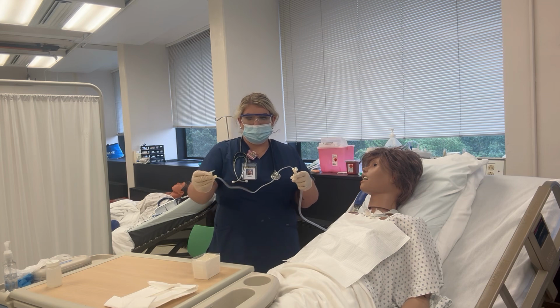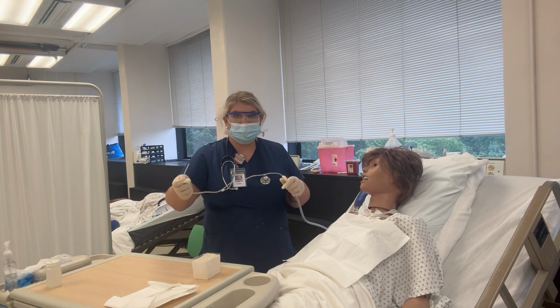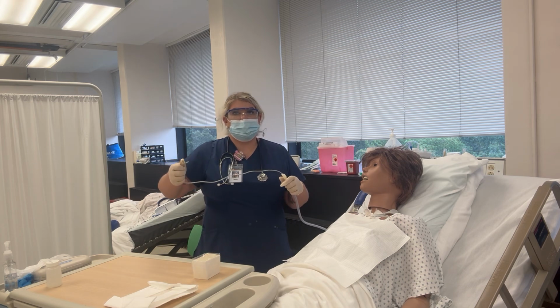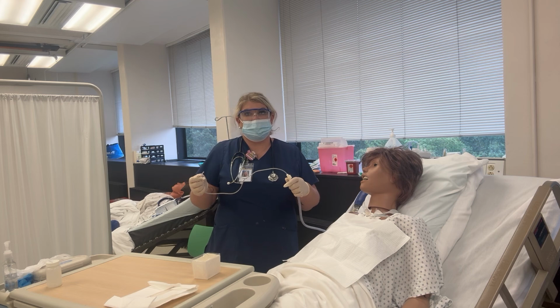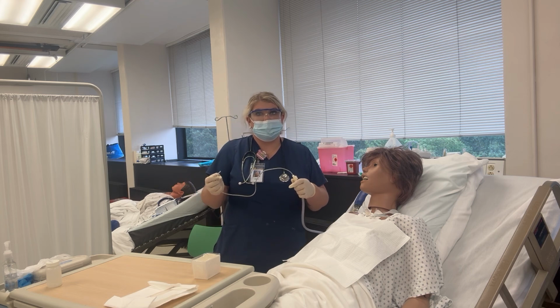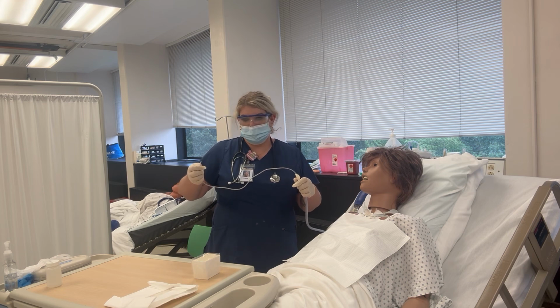Taking the very end, putting your thumb over top and dipping that in. Suctioning looks good. We already hyperoxygenated the patient. When we hyperoxygenate, we always want to do 30 to 60 seconds, no more than that, and no more than 3 times.